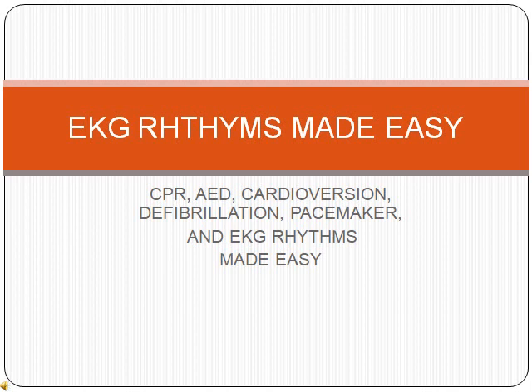It's going to go over CPR, AED, cardioversion, defibrillation, pacemakers, and the EKG rhythms.